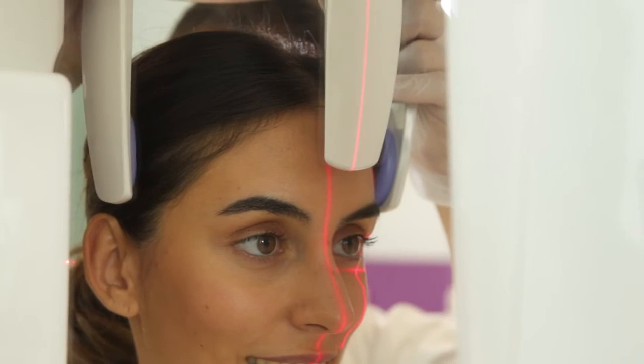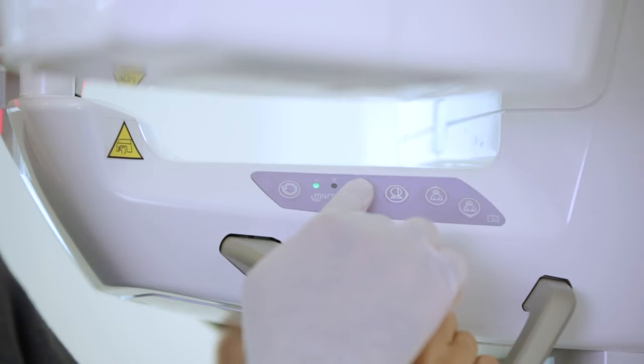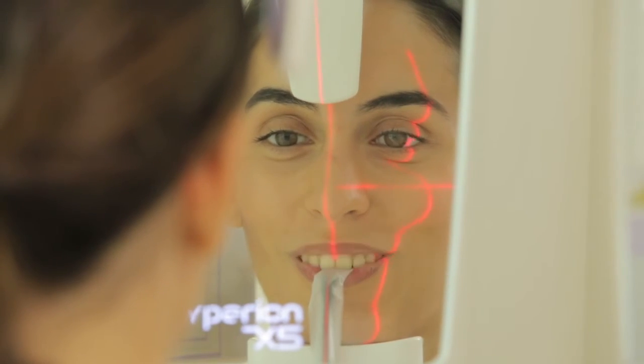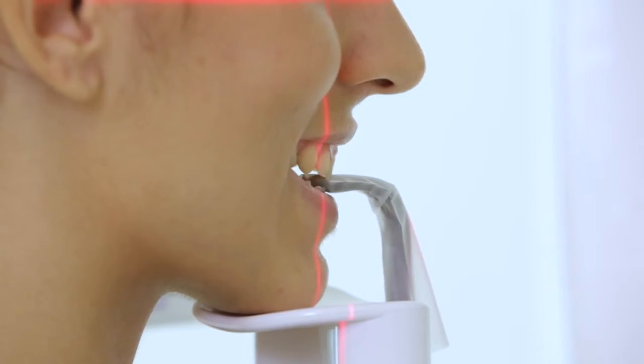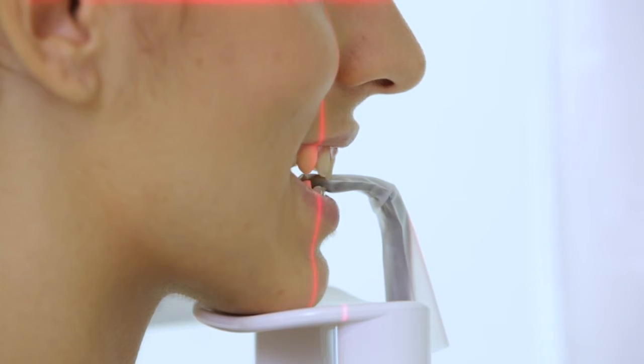In the penultimate positioning step, the dentist positions and adjusts the top ends of the stabilizing fins of the head support. Once the patient is positioned, the dentist must ask her to smile in order to expose the upper dentition. This is the time when we observe the 3rd laser beam that must hit the canine cusp. Small adjustments via the keypad are useful in order to optimize dentition focusing.